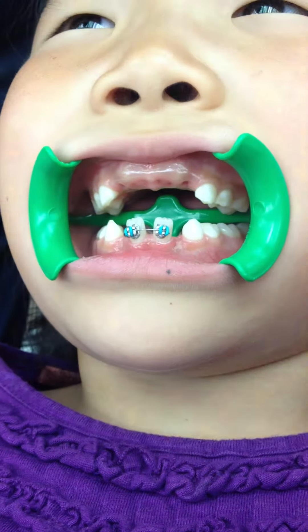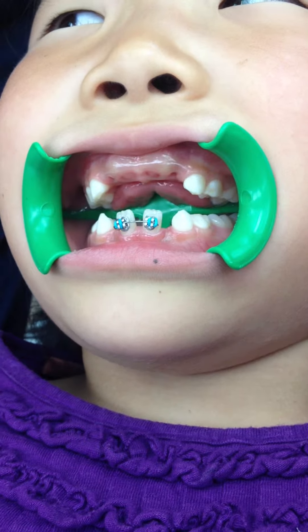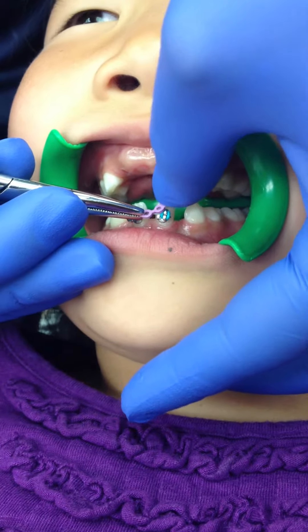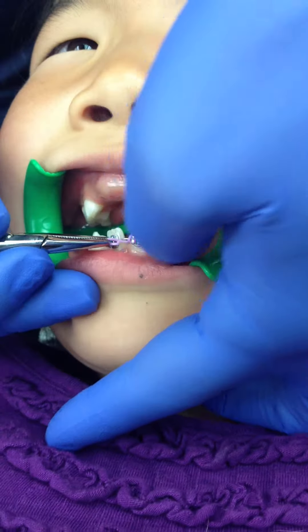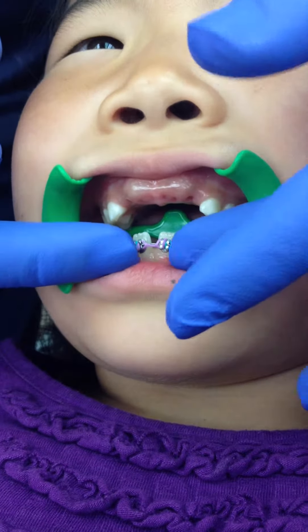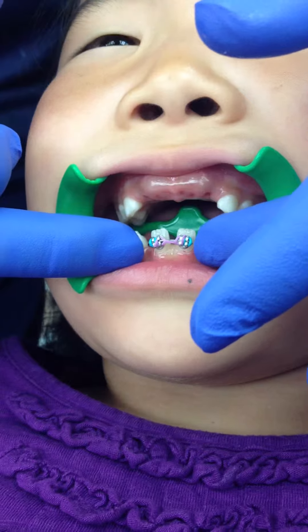And last, if we wanted to close a space like you have here, what we use is one of these little stretchy chains. You see how it's connected there? By putting it over one tooth and then gently stretching it over towards the other side, now you have colors on wire activated, and this is going to both make them straighter and close the space.